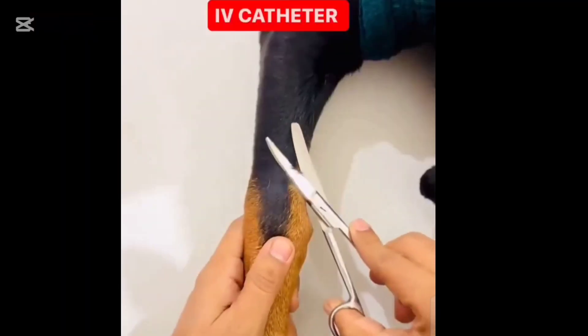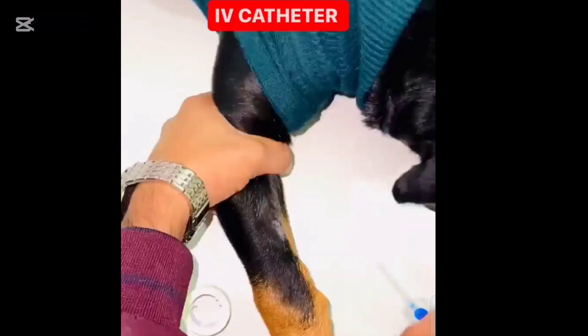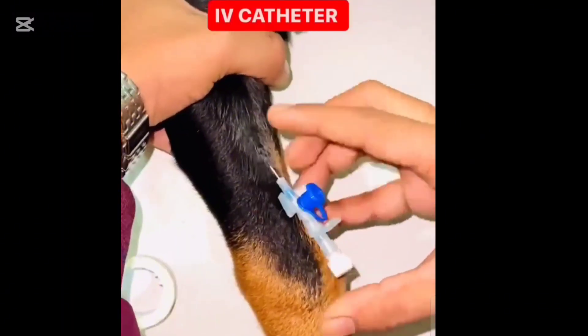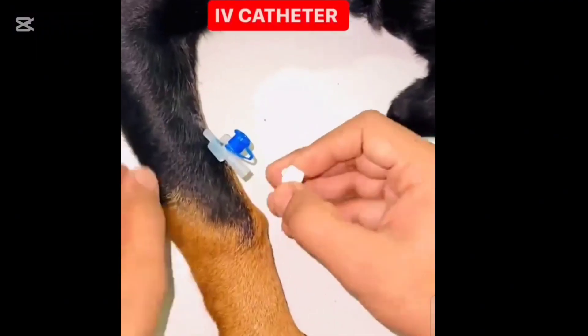Step one: clean the area with your antiseptic solution. Use a circular motion moving outward from the center — this helps reduce the risk of infection. Now take your catheter, hold it at a shallow angle of about 15 degrees, and insert it smoothly into the vein until you see a flash of blood in the chamber. That's how you know you're in the right spot.